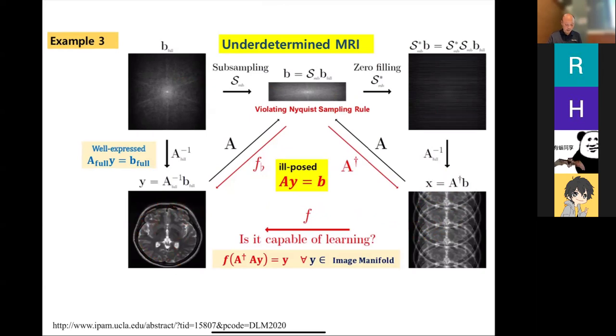Okay. And so the key is I need to find a solution that is part of what's called the image manifold. Okay, and that's the job of the training, is to figure out what this manifold is. And so the manifold is essentially this low dimensional subspace, which can be very curvy overall, but in any region it looks fairly linear. Okay, so that's all a manifold is. All right.